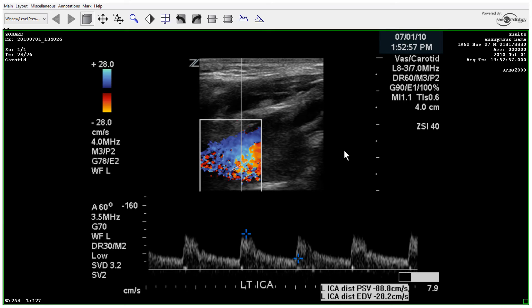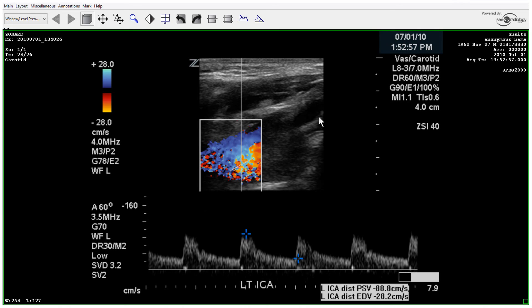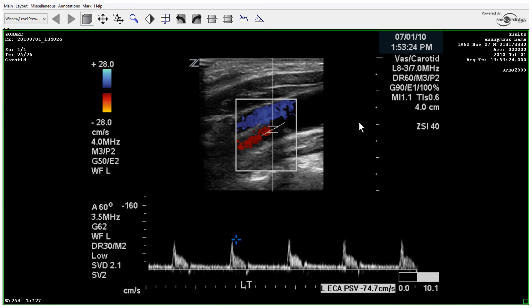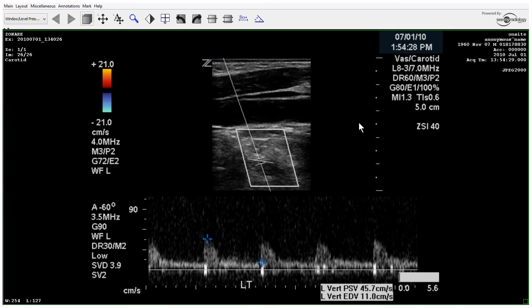We have fairly normal waveforms through the ICA on the left side. A technique point would be to clean up the image to show clear color through the lumen and to catch it in the systolic cycle. You can't really tell where the gate is, but it could have been a difficult patient who was moving. These are style points just to give the physician an idea of where your signal is.